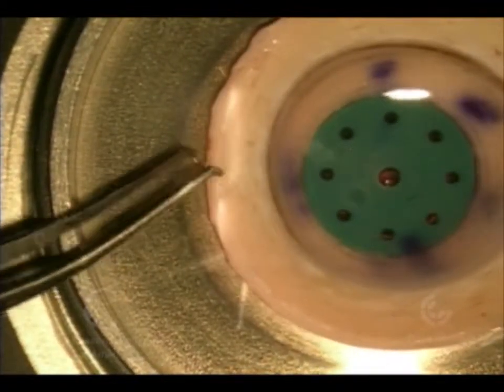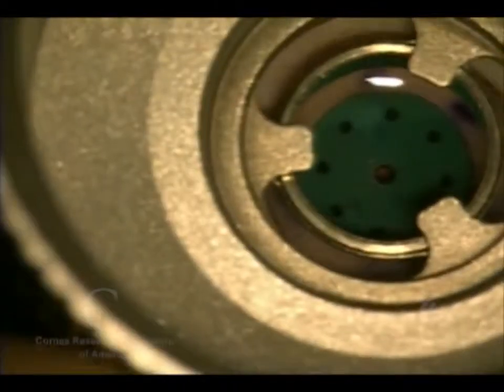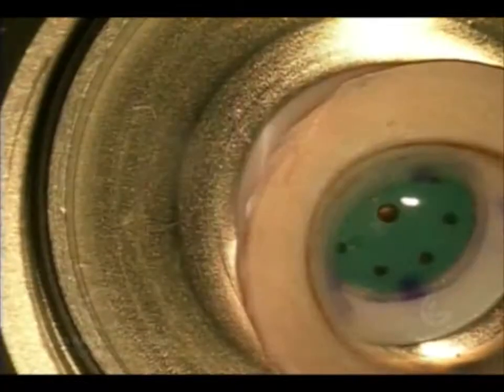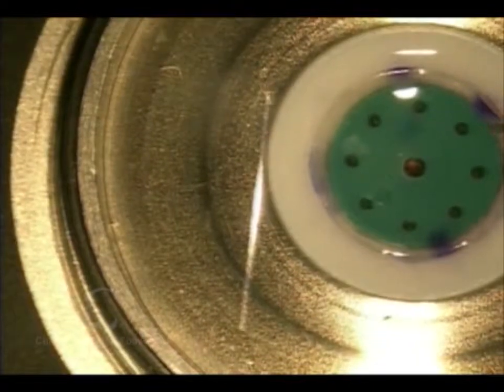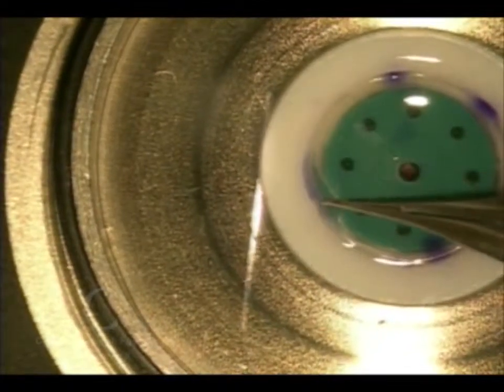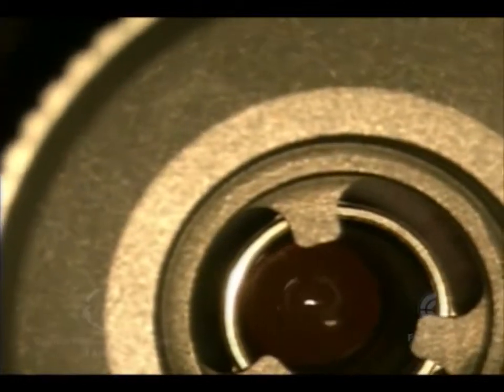This is a donor cornea. It's already been sliced with a microkeratome, separating the anterior two-thirds from the posterior one-third of the cornea. That anterior cap was placed back on the cornea, and the entire thing is placed on the cutting block and punched with the trephine — usually the same trephine that we used to mark the epithelium of the patient. The purple marks indicate the edge of where the microkeratome sectioned the cornea, to make sure that when we trephine it with the round blade, we're within the microkeratome-shaved area.